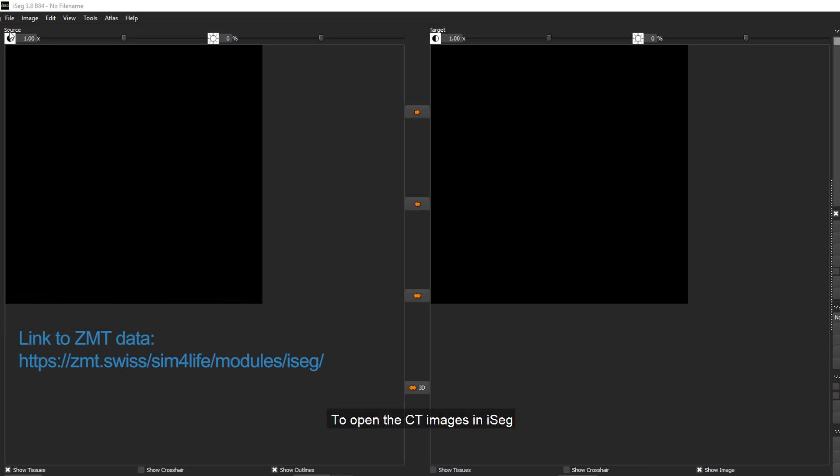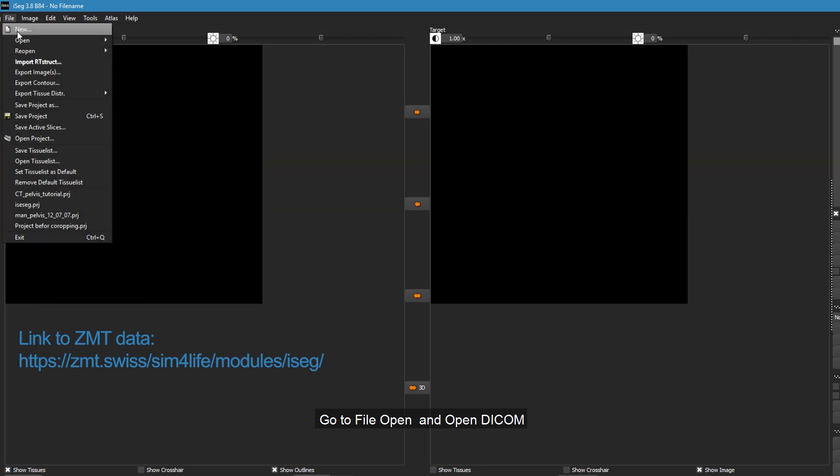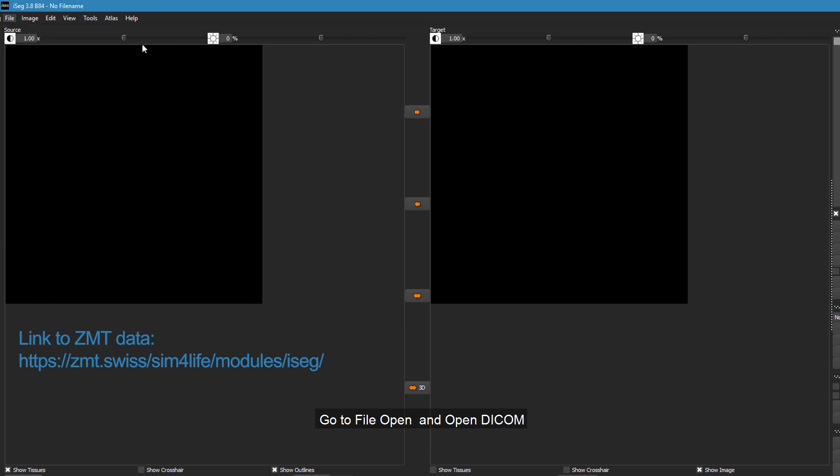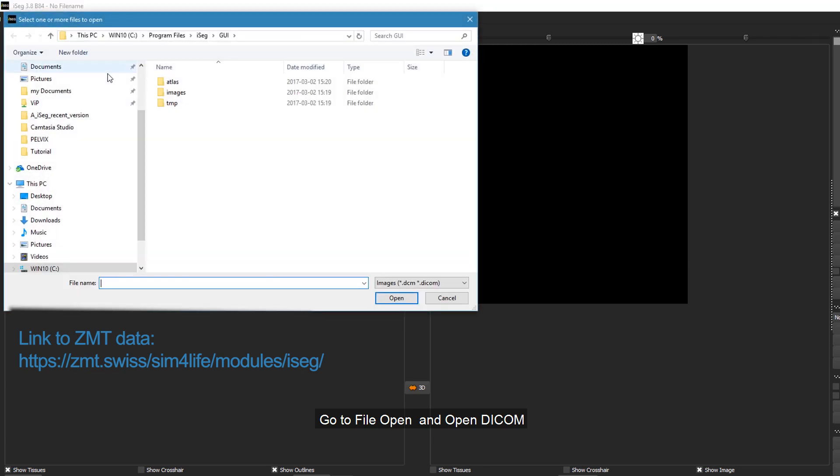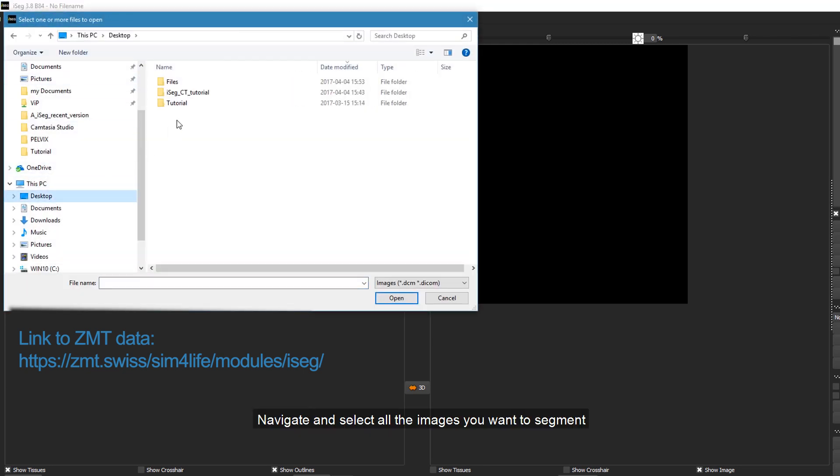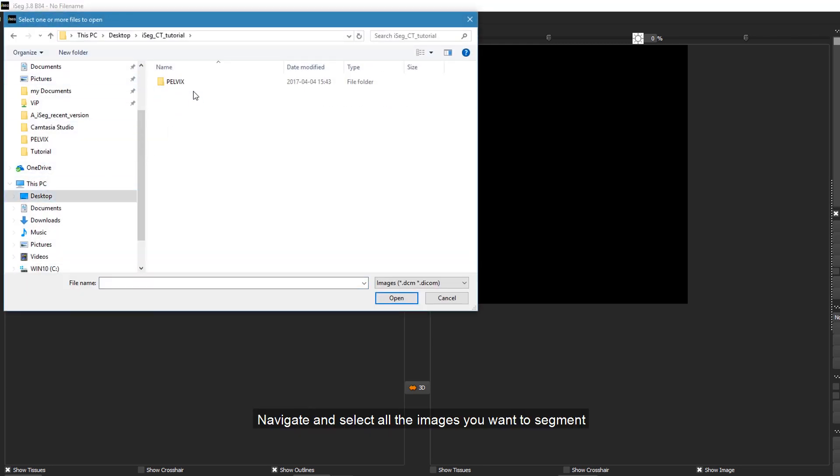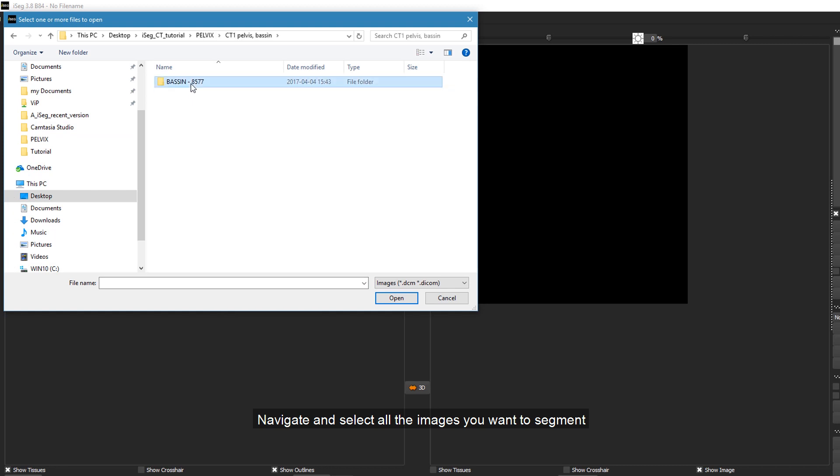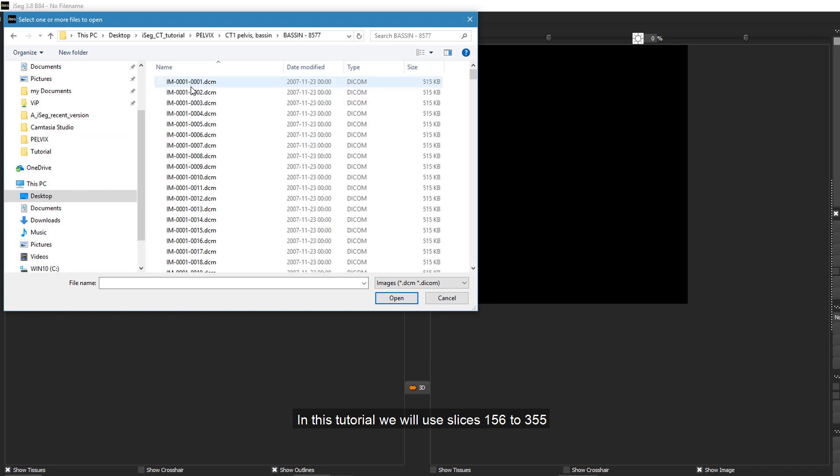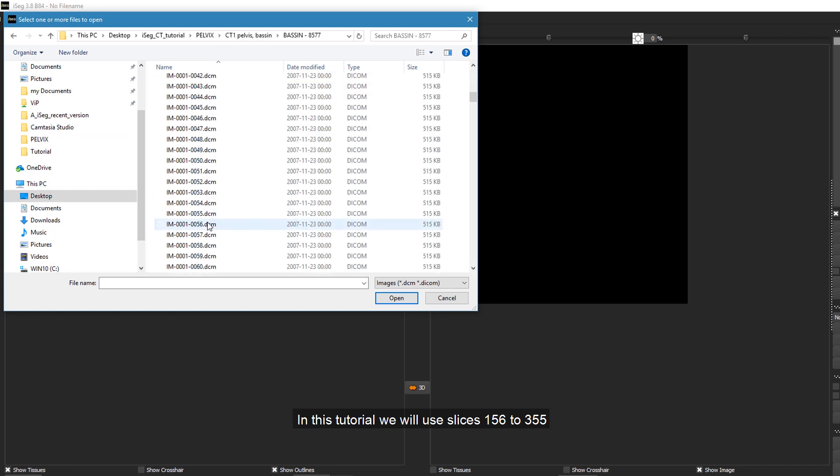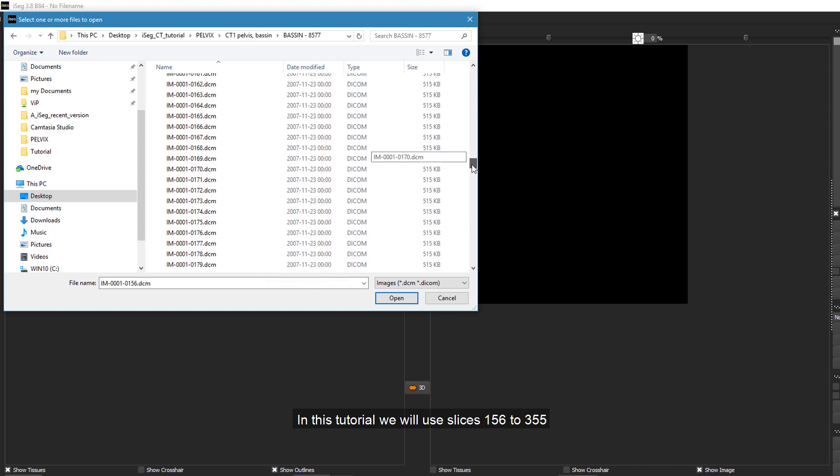To open the CT images in iSEG, go to File, Open and Open DICOM. Navigate and select all the images you want to segment. In this tutorial, we will use slices 156 to 355.